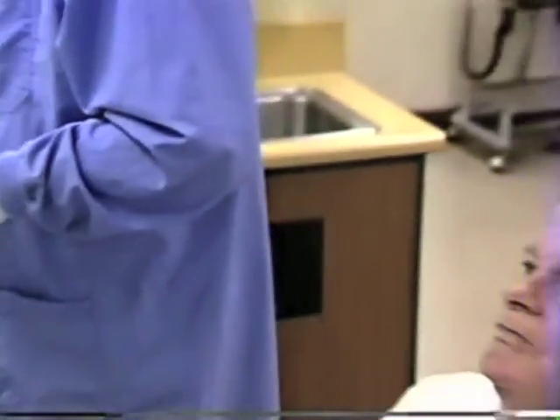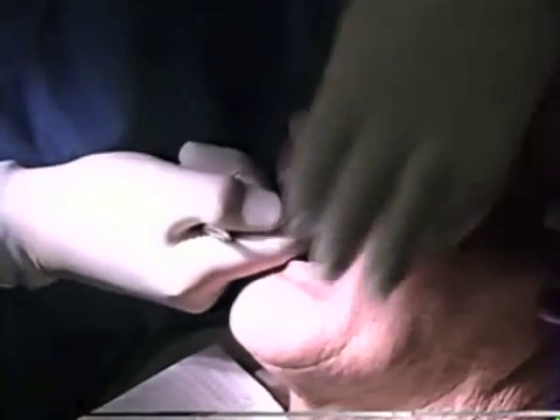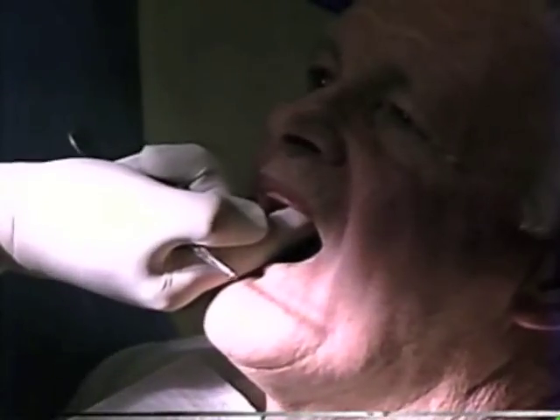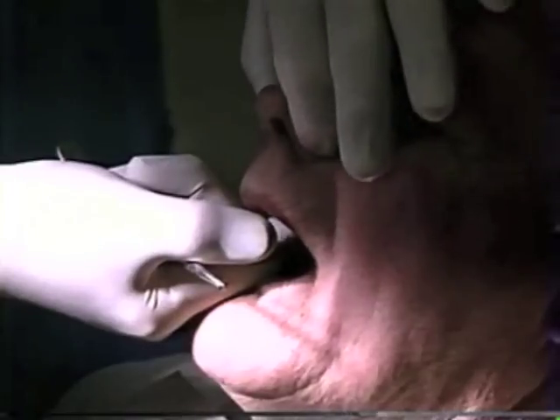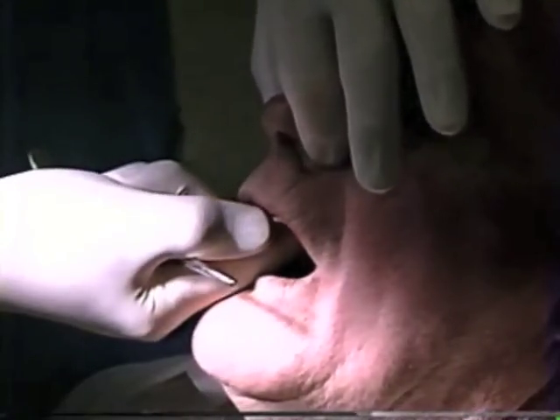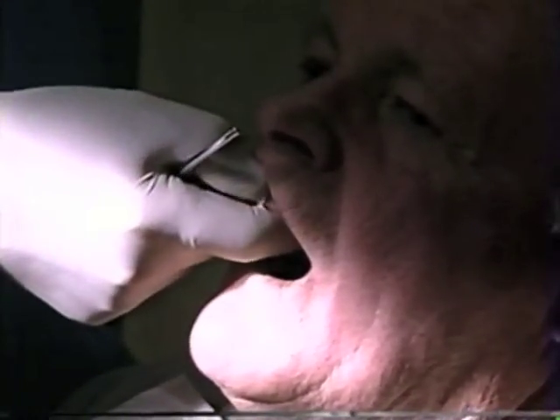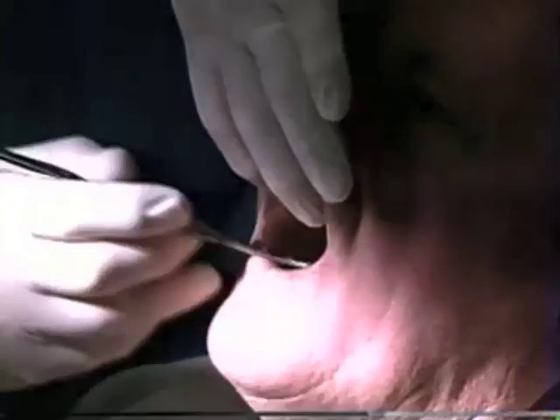Now I'm going to ask you to open your mouth and not close it for any reason until I tell you. This can be tricky. We're going to insert this into the patient's mouth and seat it very, very firmly. If you have doubts about whether the soft palate will come down and touch that, a good way is to grasp the nose. Now blow hard through your nose one time. That will force the soft palate down into the posterior edge of that rim, and now the object is to look in the mouth and see where that is.